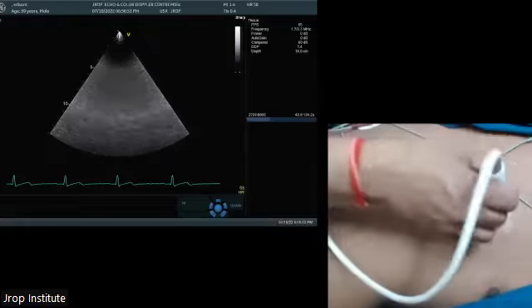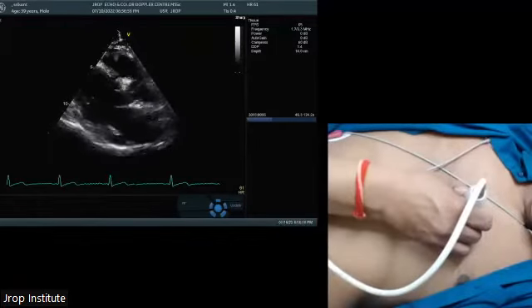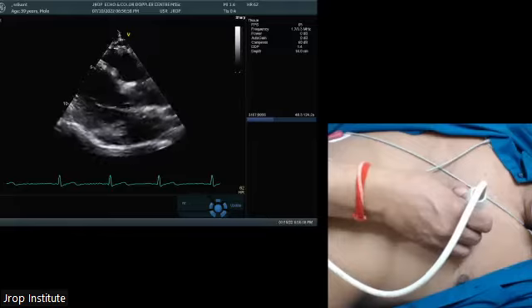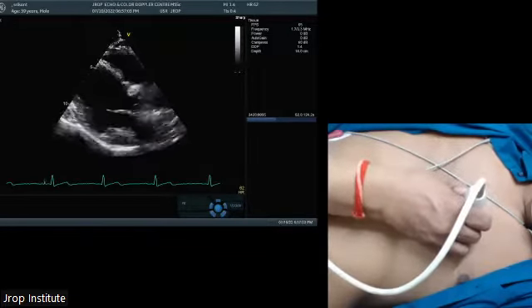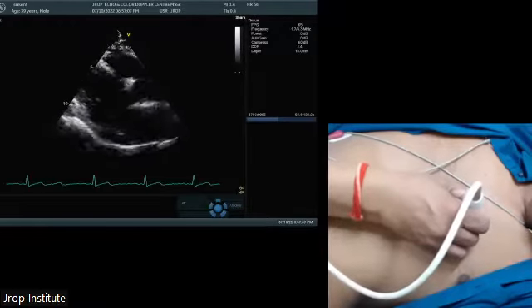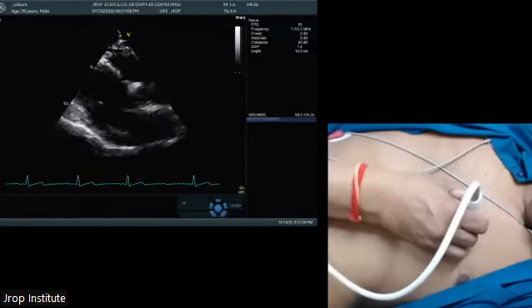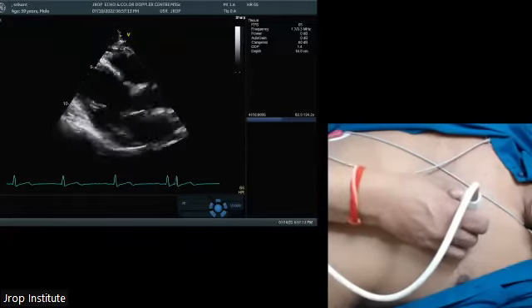Okay, sir. So I'm putting the marker at the thumb level. Okay. Got it, I know sir. Thank you. It's not going to be very easy. 11 o'clock marker, as well as somebody has written from, I don't know from where it is. They said 11 o'clock marker.